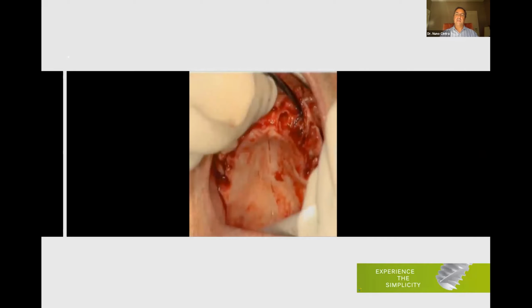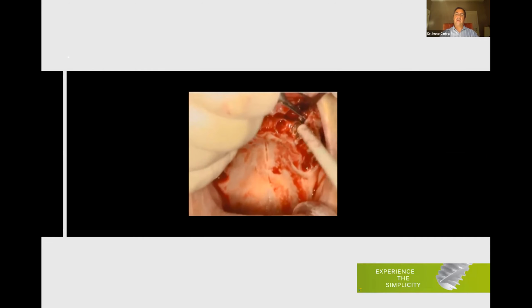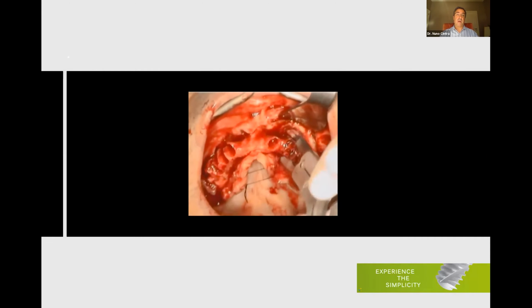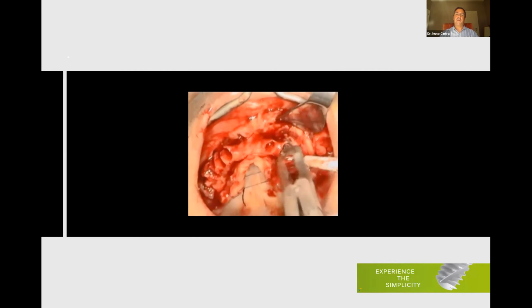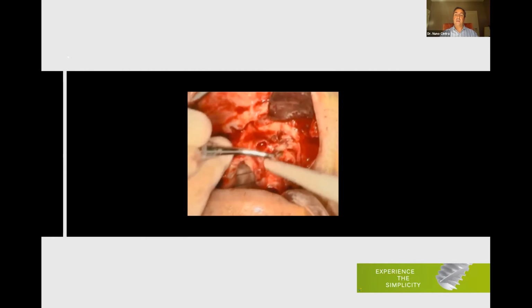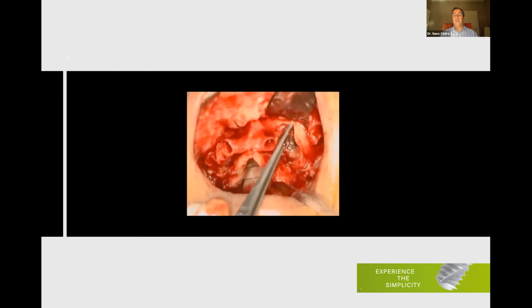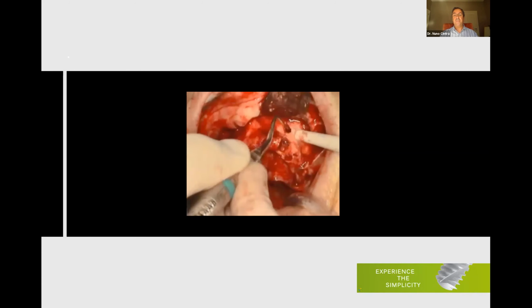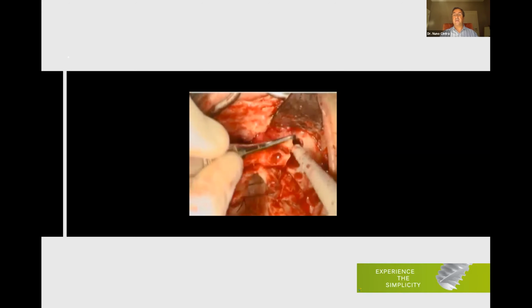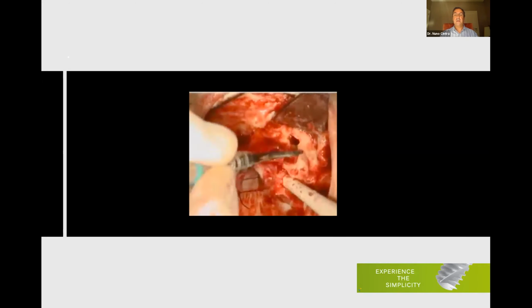Bone defects. Well, of course, most of the time we deal with bone defects, mainly when we have extractions. In a case like this, most of my cases, we have extractions to do. So after extractions, sometimes we have to deal with bone defects. A case like this one, there's a big lesion. We have two cystic cavities related with this canine. That's not the sinus, that's the second cavity, okay? I will show you that that is not the sinus because I will open the sinus, as the protocol says.